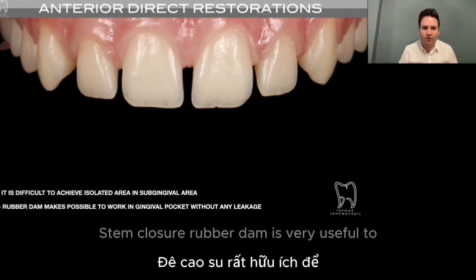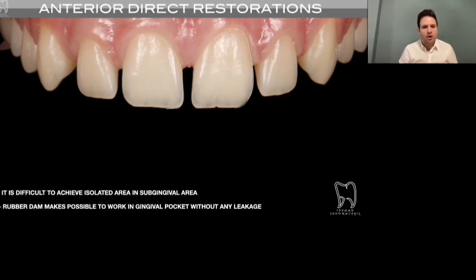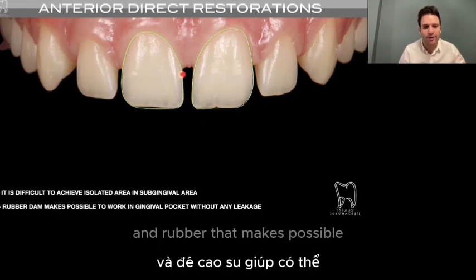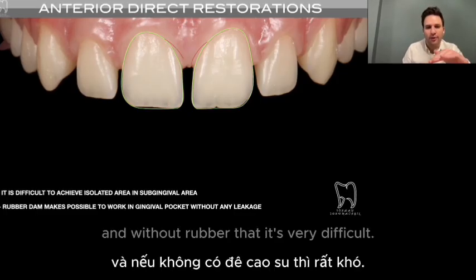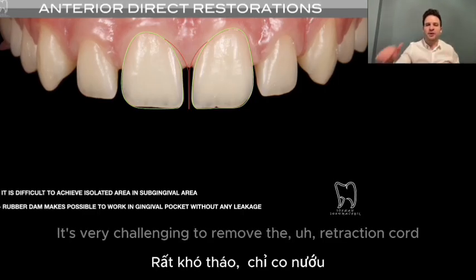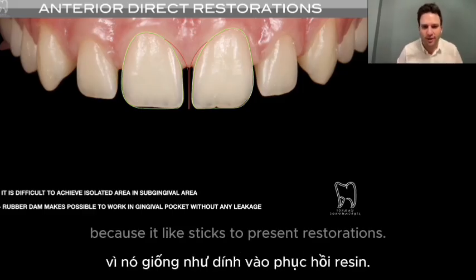Rubber dam is very useful to create a more anatomic proximal wall, because it's difficult to achieve an isolated area in the subgingival area, and rubber dam makes it possible to work in a gingival pocket without any leakage. Without rubber dam, it's very difficult. You may do it by using retraction cord, but it's very overwhelming. It's very challenging to remove the retraction cord after the restoration, because it sticks to resin restorations.